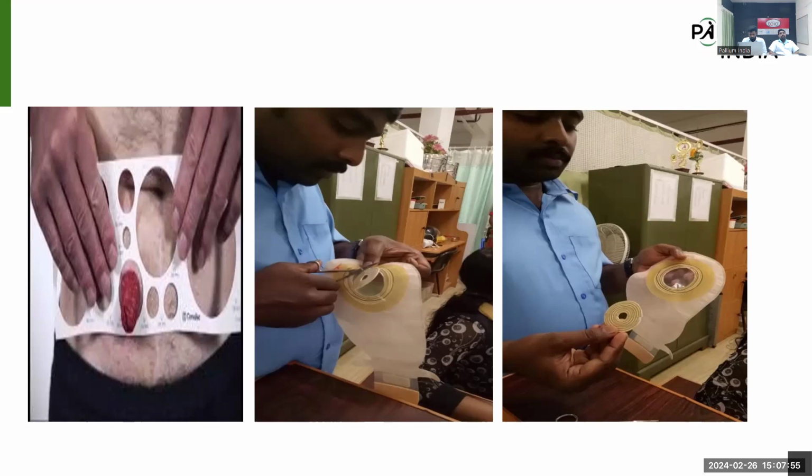For example, we can consider it maybe 35 millimeter. Then we need to take 3 to 4 millimeter bigger than the actual size. We need to mark it on the back side of the base plate or the wafer part of the colostomy bag. Then it will become around 37 or 38. Example, I'm telling. Then you can use a curved scissor. Curved type of scissor you can use, and you can cut according to the stomal size.